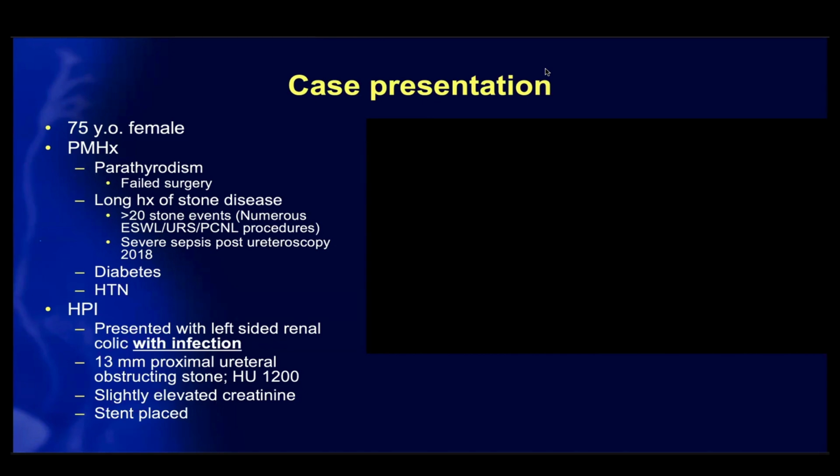We're figuring out how we can use this scope and the information we can get. If you remember Abdul's presentation, he talks about 30 millimeters of mercury, which is really low. All the videos we've shown you have been higher than that, so we need to figure out cutoffs. But here's a clinical application of the scope, in our opinion.